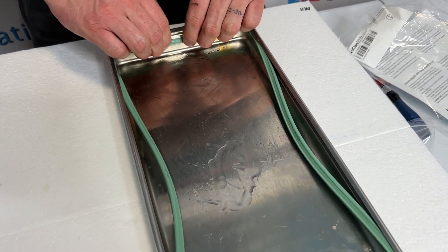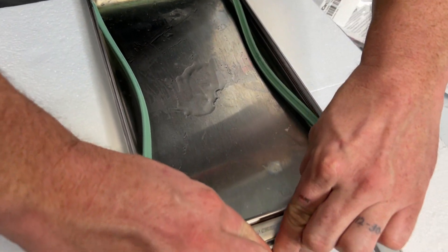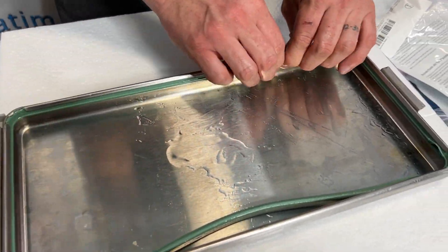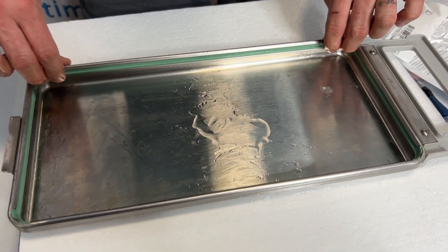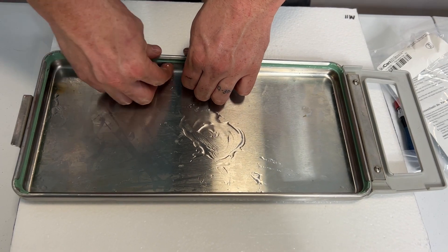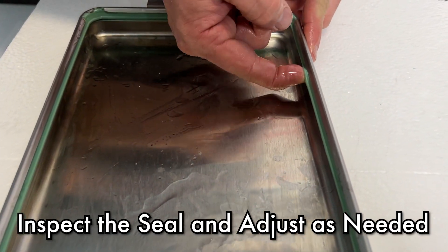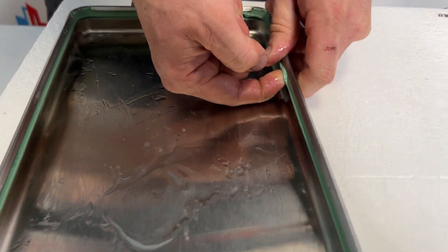Once all four corners are done, go to the back and I'm just going to roll this seal into place. Do the same on the front. And that should be pretty well set. I'm going to take a finger and put it between the groove of the seal and just work it around and make sure that those nubs are getting right where they should be.